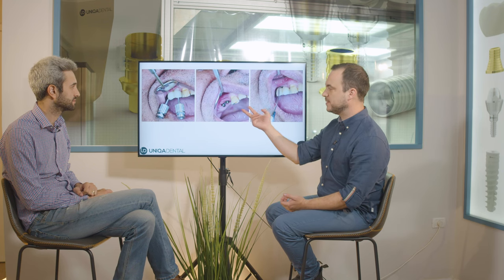We mounted the temporary bridges and closed them with plastic pins. We want to make sure that everything is fine. We have one big bridge, one small bridge, and one bridge with a cantilever. We can see that the occlusion is fine. Because of the close proximity between the implants, we did want to leave some space between the crowns so the patient could clean between the implants and food won't get stuck.